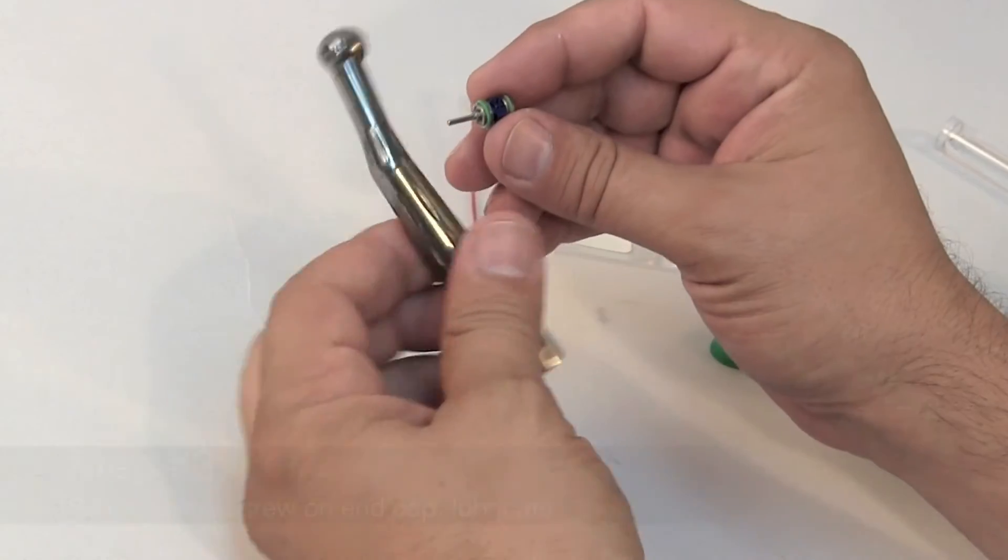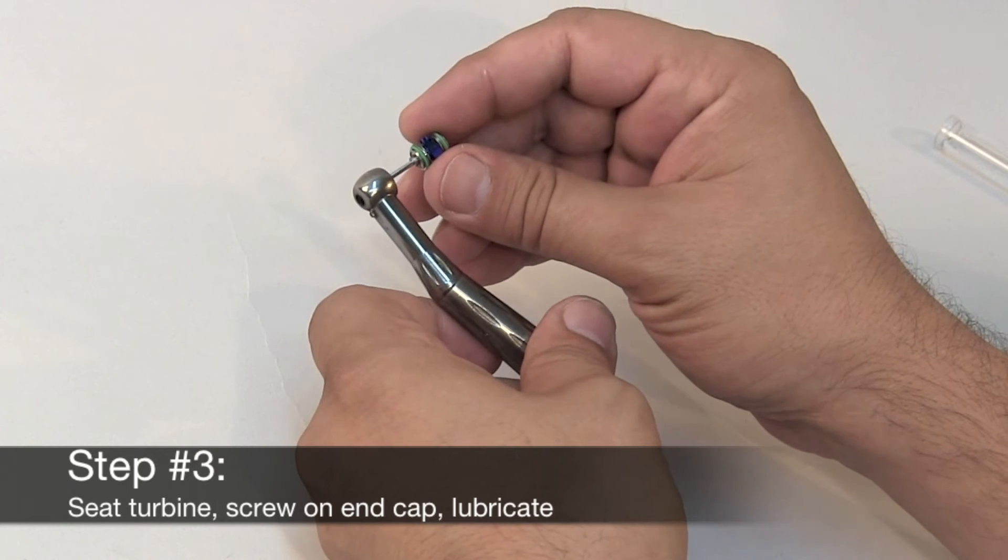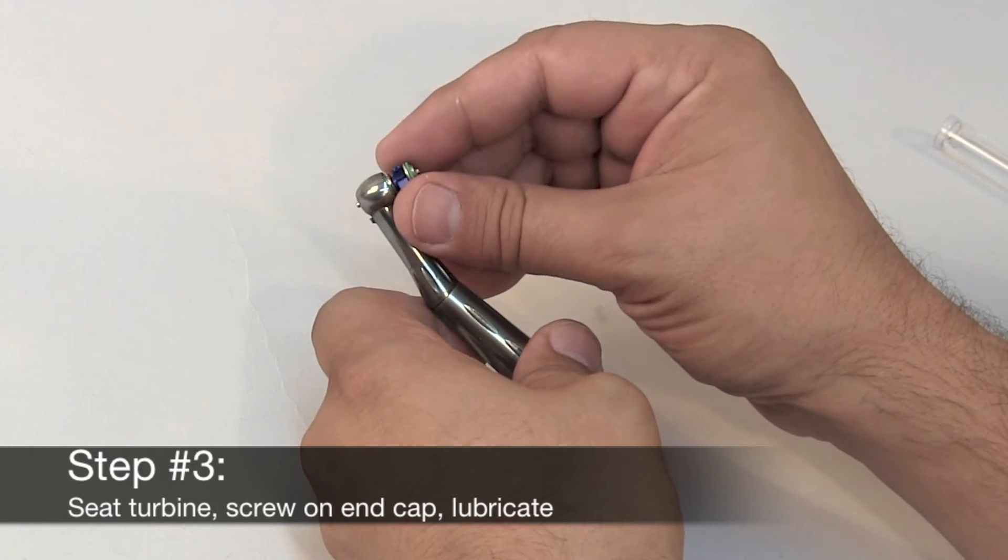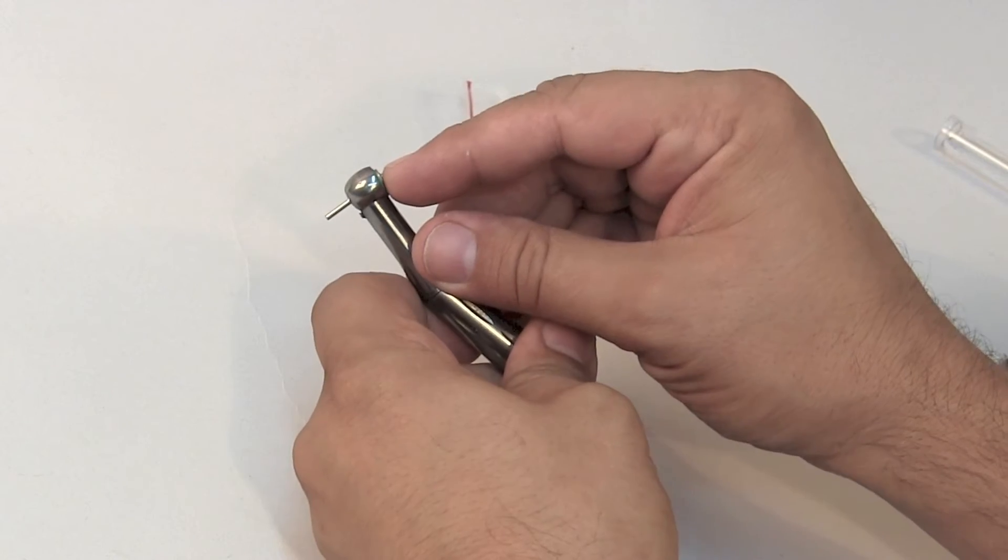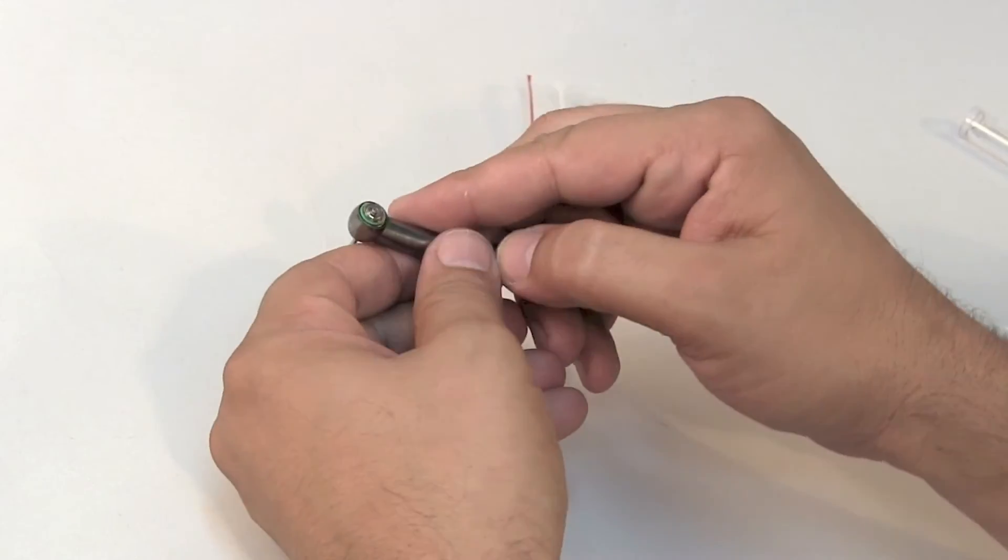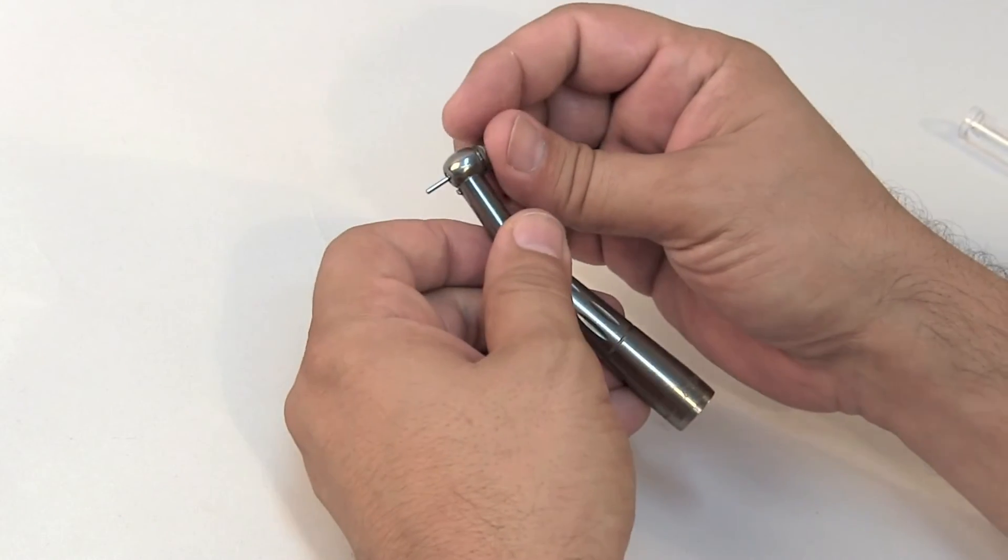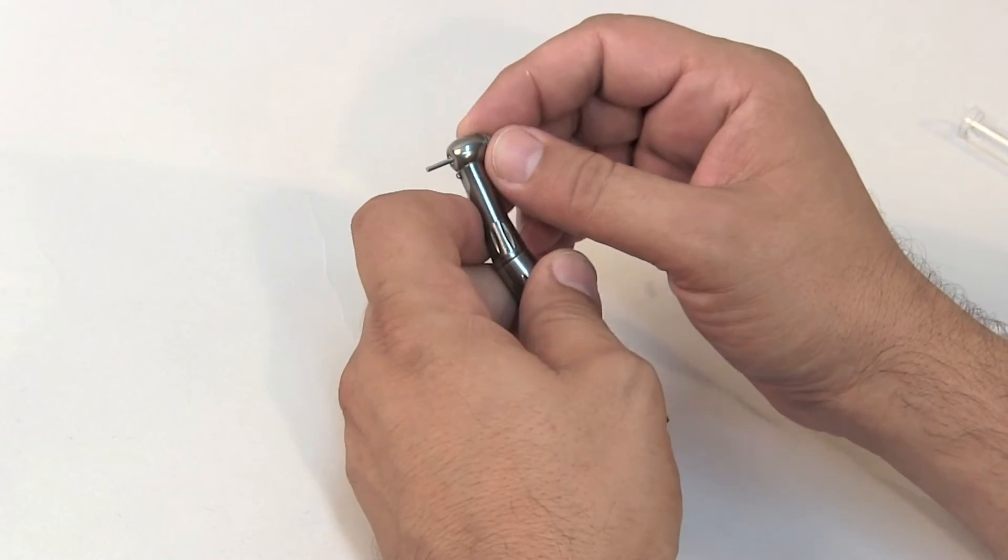Now it's time to install your turbine. Insert the turbine fully into the handpiece head. Use your end cap wrench to screw the end cap down until flush against the handpiece head.